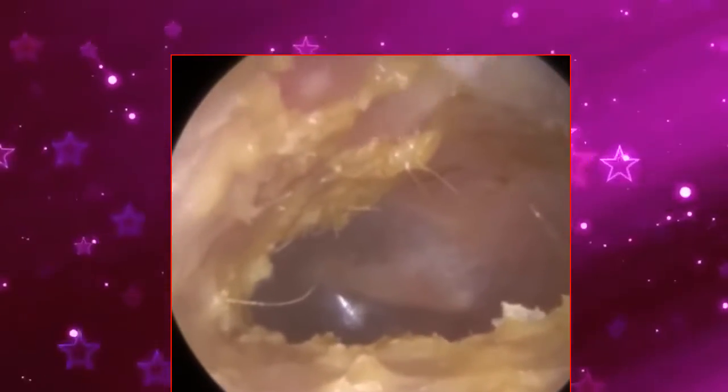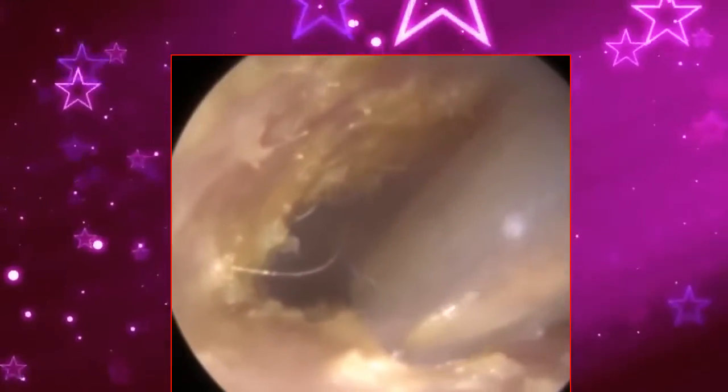So you can see the eardrum there in the distance now. The patient can hear significantly better, but I just want to get as much debris off the canal wall as possible. It's really, really difficult because, again, I made reference in previous videos to that game of Operation, which I was playing with the ear.